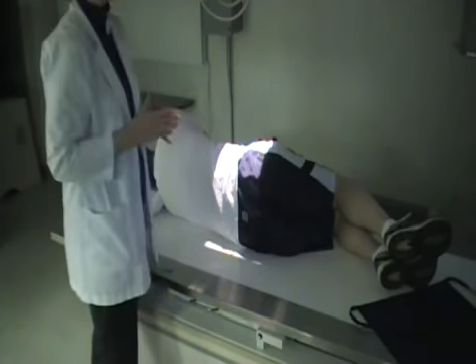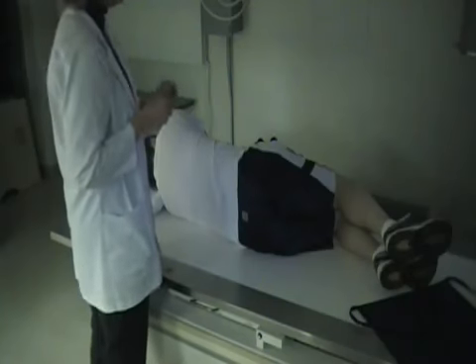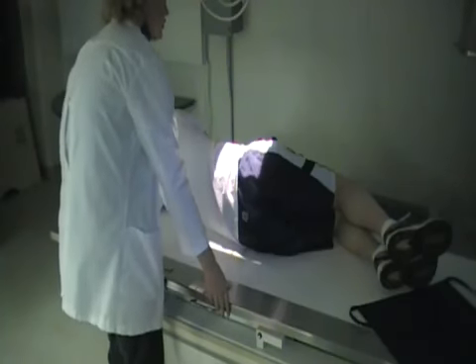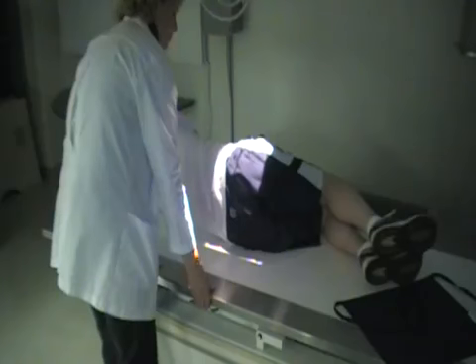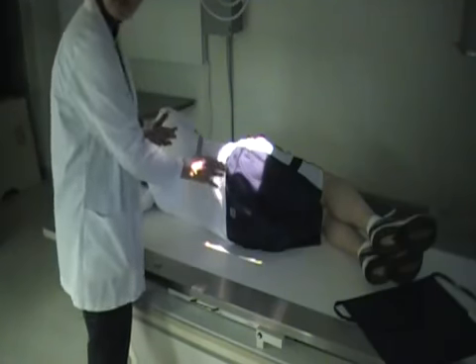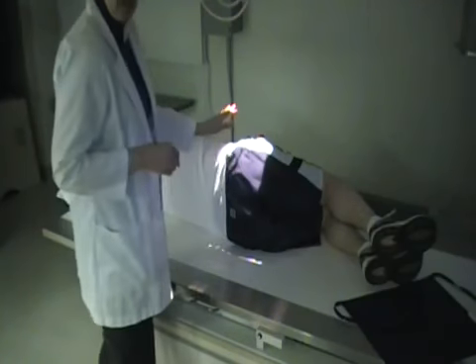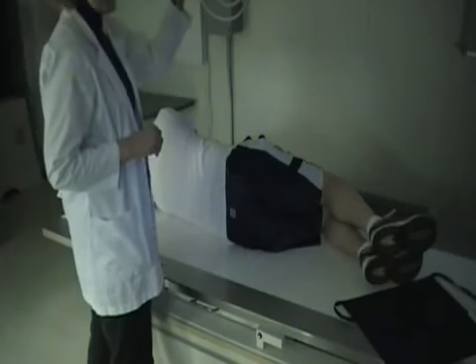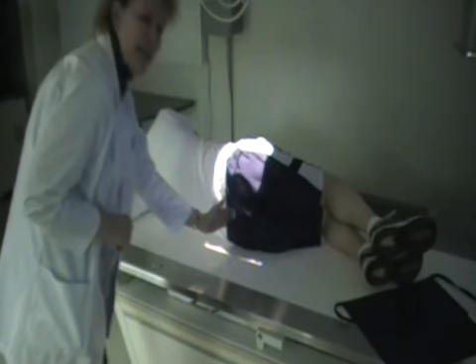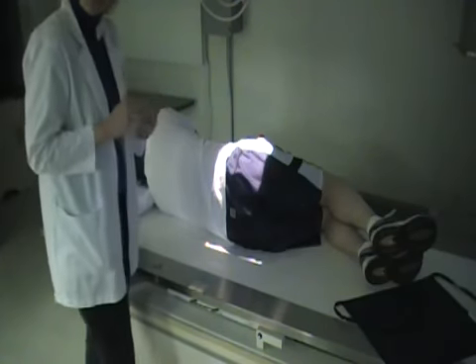Now, this will include the coccyx as well if the doctor does want the combined series. If he wants the coccyx zeroed in on, centered over, what you're going to do is just move this down 2 inches. And you will be more directly over the coccyx. Now, some technologists like to palpate the coccyx and they know exactly where they're at. If you do not wish to palpate the coccyx, remember the coccyx is at the same level as the greater trochanter prominence. So here we are at the greater trochanter prominence, and it's cutting down, and this would be our coccyx area. So just keep in mind, the greater trochanter, the coccyx, and the pubic symphysis are all lying along the same line.